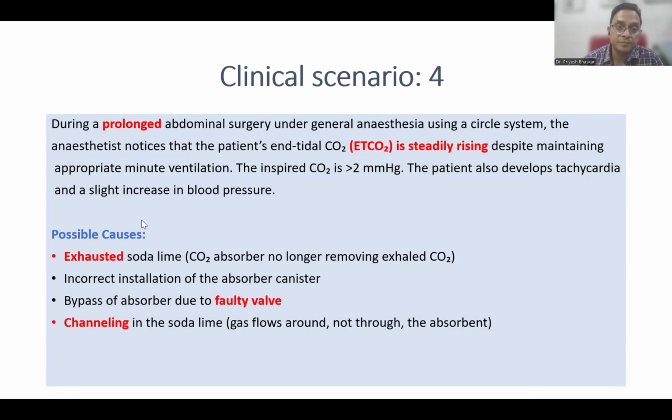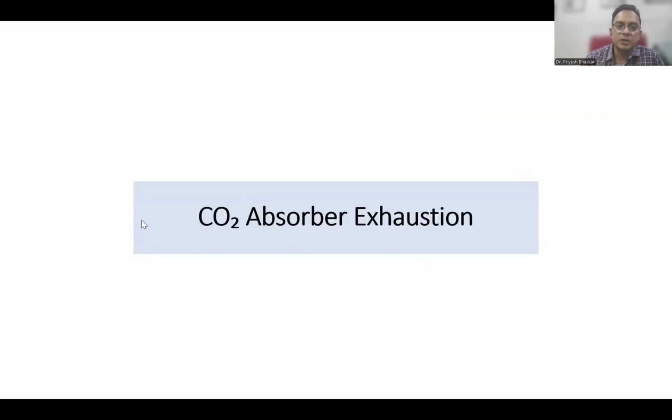Exhausted soda lime, incorrect installation of the absorber canister, bypass of the absorber due to a faulty valve, yes, and channeling of the soda lime, right? The gas flows around and not through the absorber. Okay, so it's a case of CO2 absorber exhaustion.